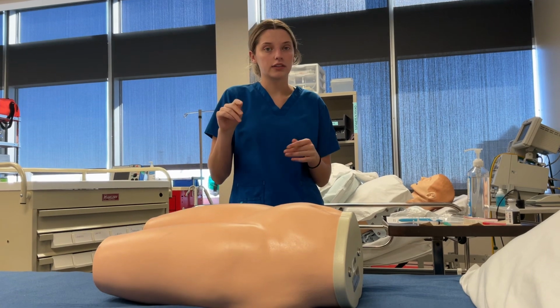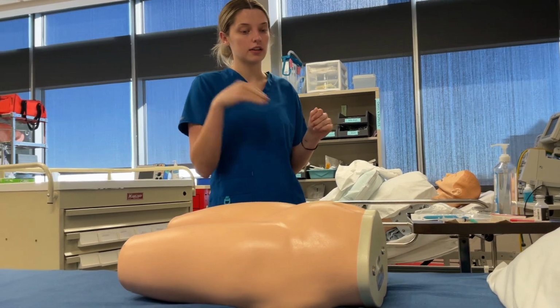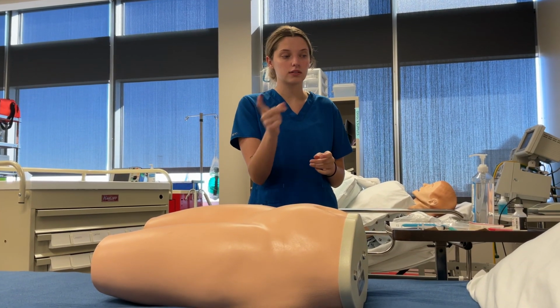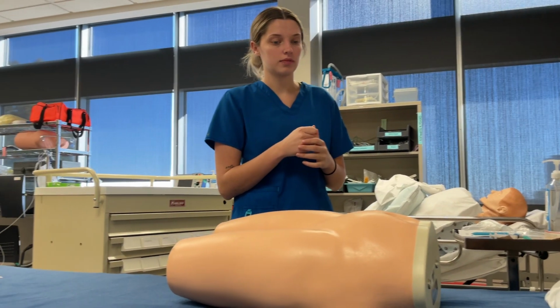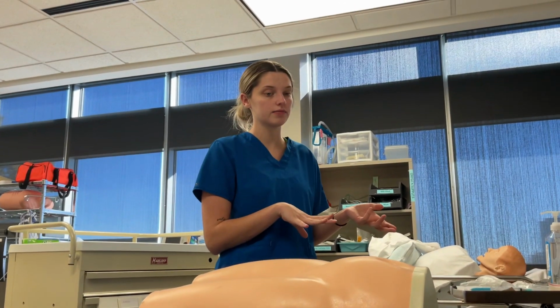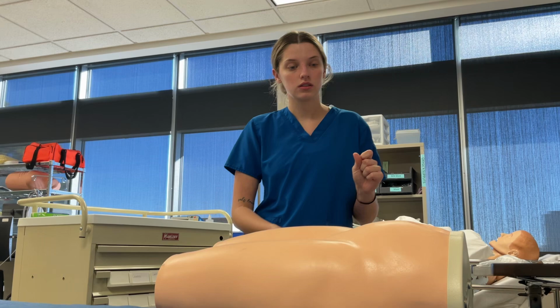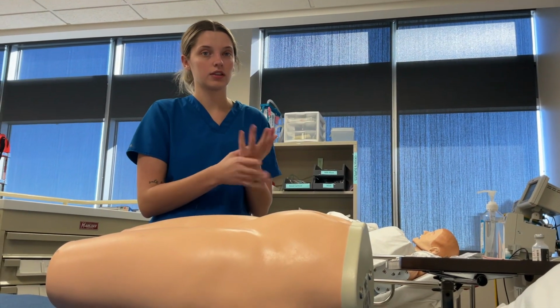Just gonna make sure I got everything. And just make sure I am saying the site, the vastus lateralis greater trochanter. Scan the wristband, scan the medication. Said I could give it because it hasn't been given yet today. Hold the skin taut, get in a relaxed, comfortable position. Okay, you can stop it.